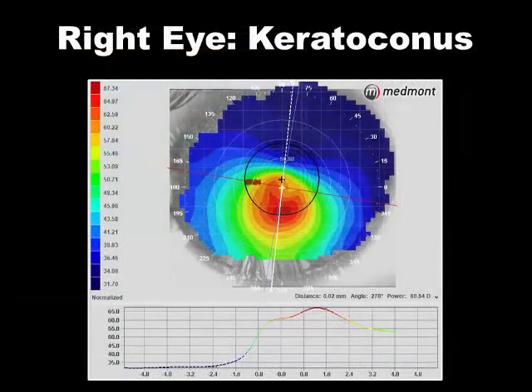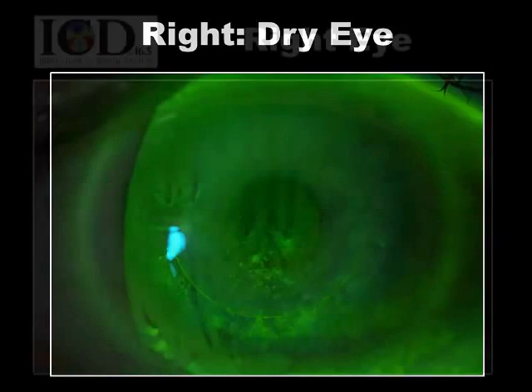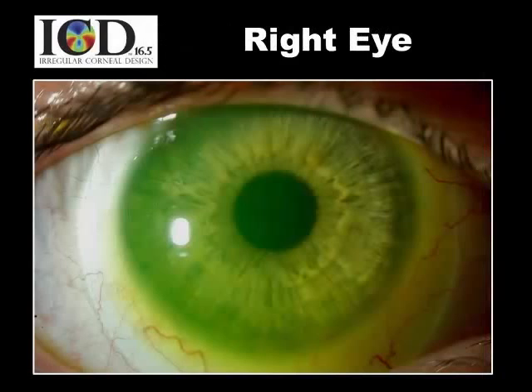So let's take the corneal topography and determine the right first lens. And you'll notice also that we have the ocular surface disease that gives this patient some pretty severe dry eye. So not only do we have this very steep cone in the neighborhood of 67 diopters, but we're also dealing with a dry eye patient. So the scleral lens might be a good option because we can vault over top of this asymmetry as well as provide a barrier of fluid between lens and cornea and try to ease this patient's dry eye symptoms.